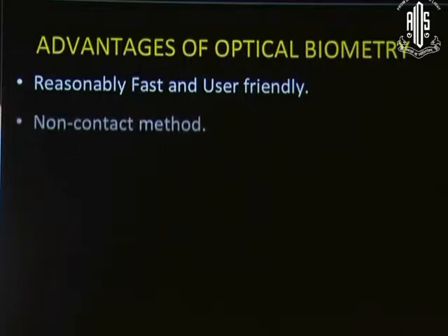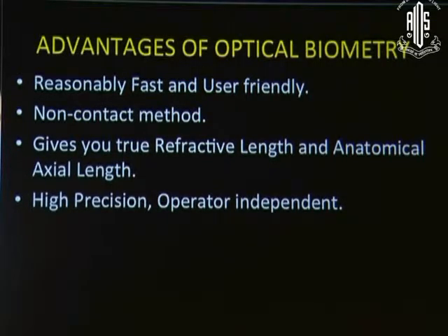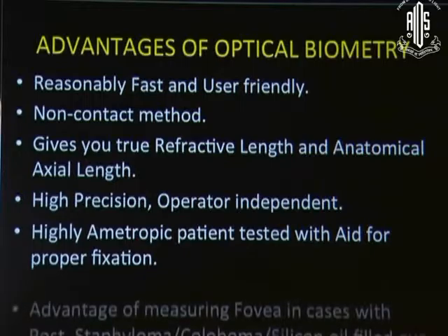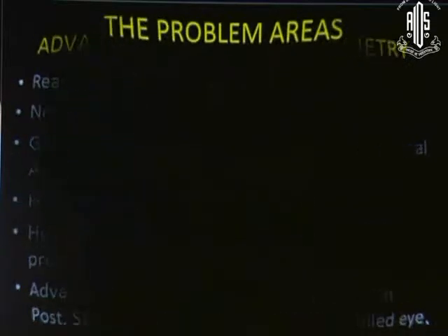The advantages, of course, it's reasonably fast and quite user-friendly, non-contact, of course, and it gives the true refractive length and anatomical axial length, highly precise, and the ametropic patient is tested with the aid of proper fixation. The advantage of measuring the fovea in cases of posterior staphyloma, the coloboma and the silicone-filled eye is very important, and all the results go in.